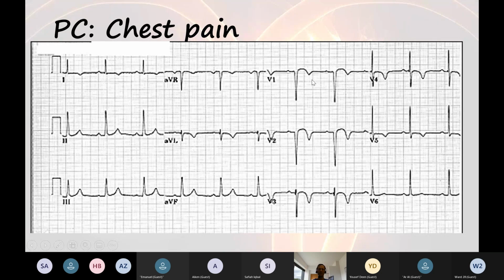So if the patients you're seeing with chest pain and you see this ECG, that's something where you think, is the pain within the last 12 hours? Is the pain ongoing now? And that's the kind of ECG that if they're in pain, you don't think it's an acute episode related to that pain necessarily, but they need immediate assessment.